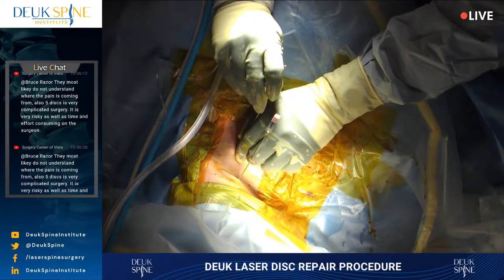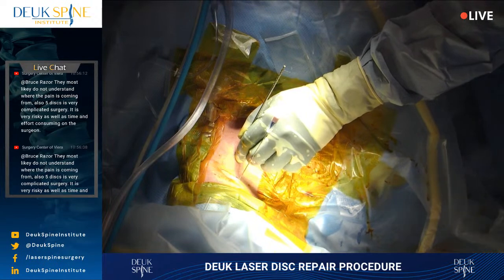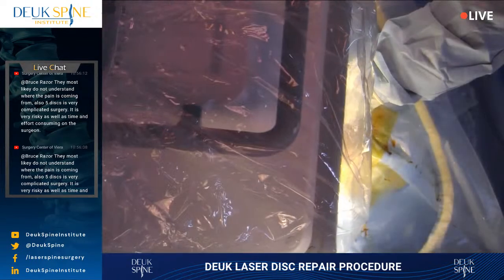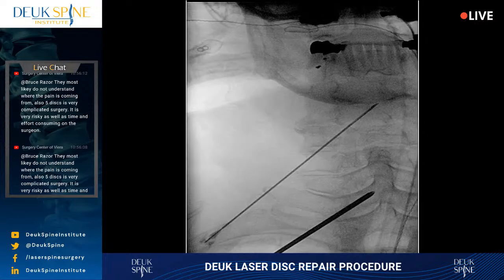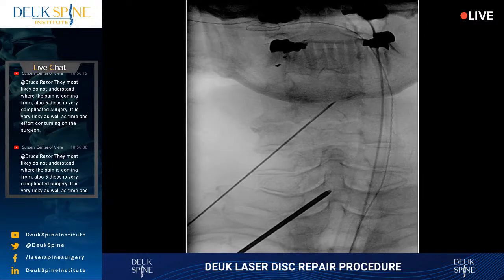Give me an AP. Take your time. Give me a good AP. Coker. I don't want to radiate my fingers. And if you're wondering what the black gloves are, those are radiation gloves. They basically give me some protection of my hands against the effects of radiation. Please, please, please get the APs right. All right, it looks good. Shot. Let's just get a little more centered shot.